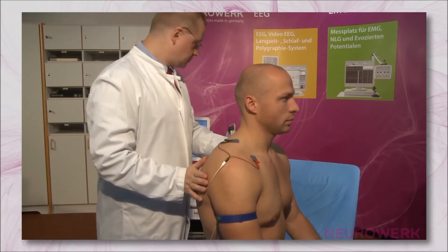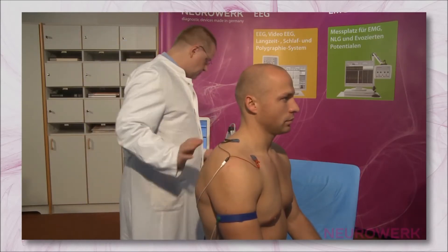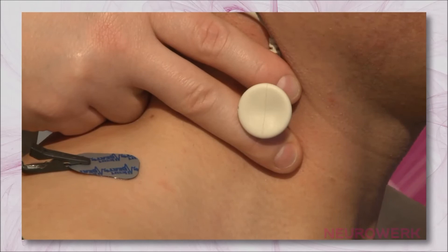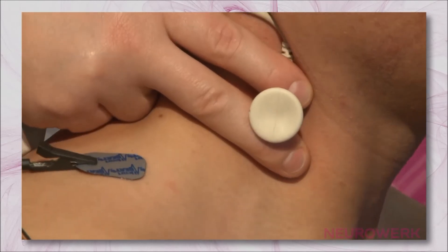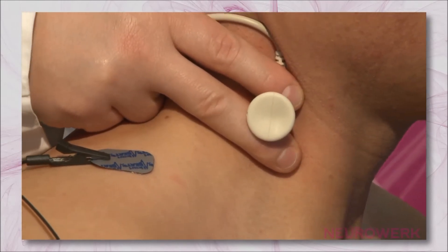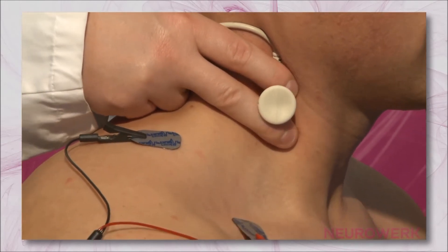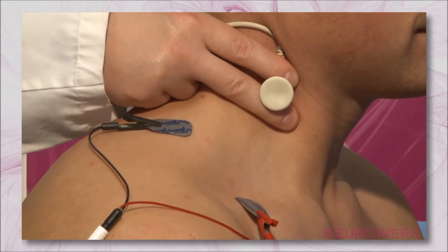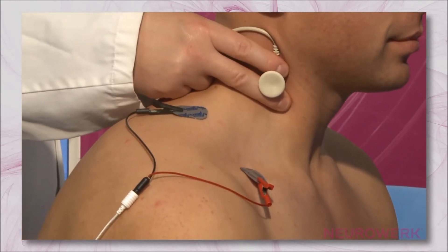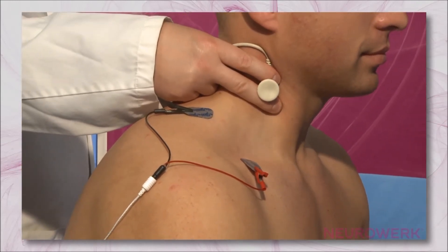This is a neurological disease that is characterized by stress-related muscle weakness. In this instance, the examination will be demonstrated on the accessory nerve. However, it should be noted that it is also possible to examine all other motor or mixed nerves.